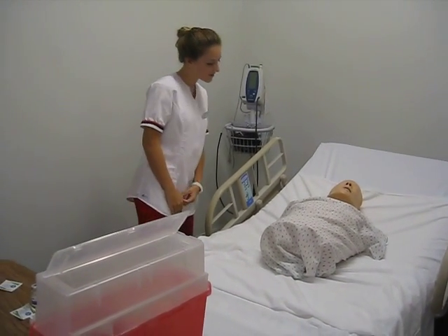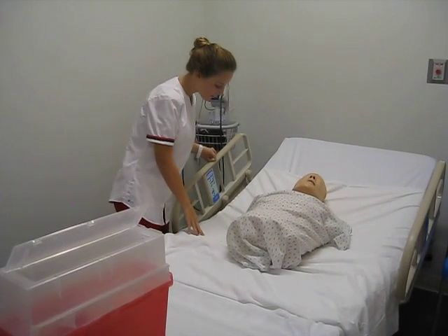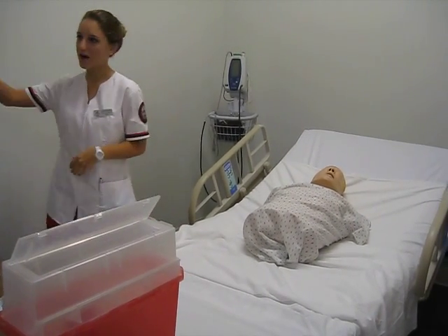Hello, my name is Jamie and I will be your student nurse today. Can I go ahead and have you confirm your name and date of birth for me? Okay, thank you. I'm going to close the curtain to ensure our privacy.